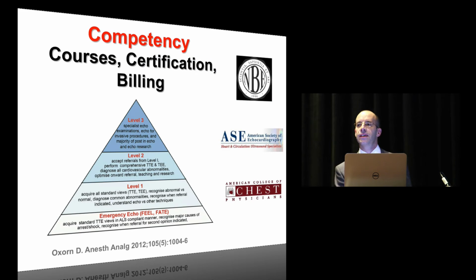The problem with TTE is that a lot of other applications of ultrasound are pretty easy to learn. IV access is easy. A TAP block is relatively easy. Neuraxial, even though you might think it's difficult, is actually pretty easy to pick up. But this is definitely a different level, so it takes investment on your own side to start learning the technique. I'm still evolving, and the whole field is still trying to learn. The good thing is that we're right at the bottom of that pyramid, where the focused exam is. We're not in that category up there where the cardiologists lie. So it's really just a base level to get you important clinical information to change your practice.